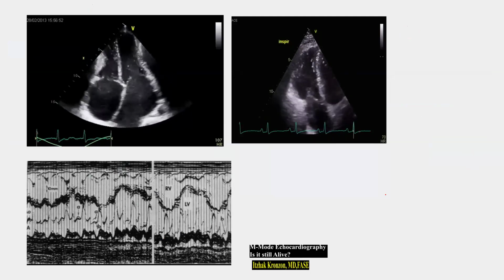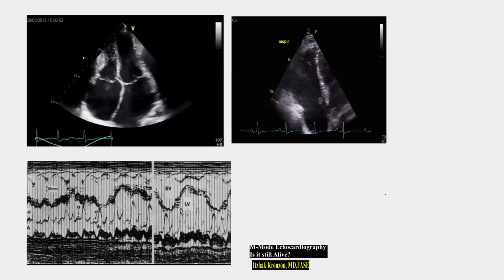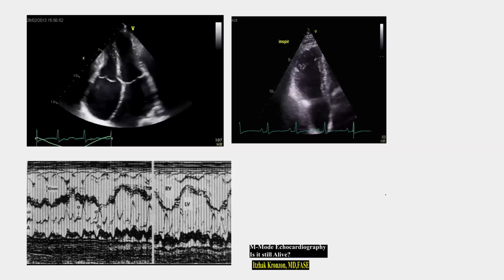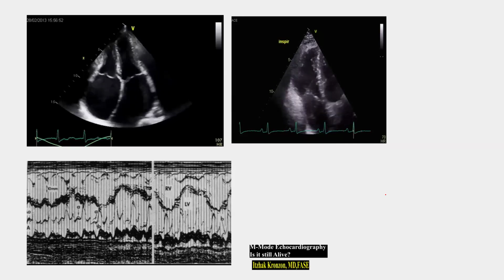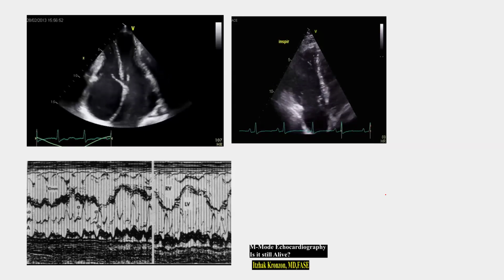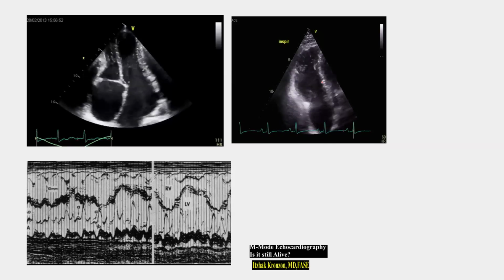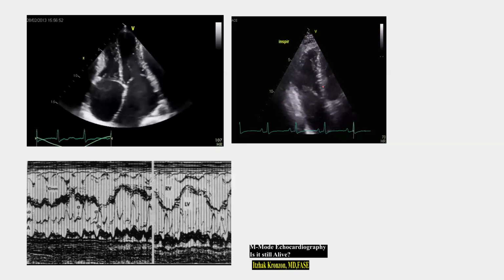By the way, when we talk about septal bounce, you cannot see it in 1 beat or 2 beats because it is respirophasic. During inspiration, it goes leftward. During expiration, it goes rightward. So to have 2 respiratory cycles, you need how many? You need 6 to 8 beats. So for septal bounce, you better elongate your tracing to cover at least 10 beats to catch it. Notice it doesn't come right away. See, 1, 2, 3, 4. It came with beat number 4, septal bounce.